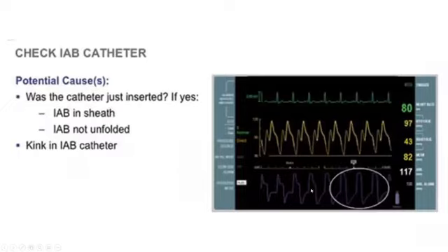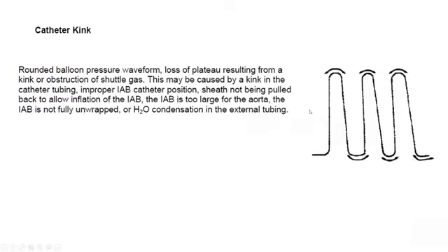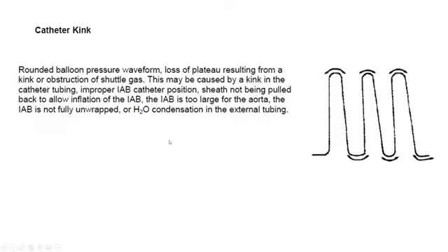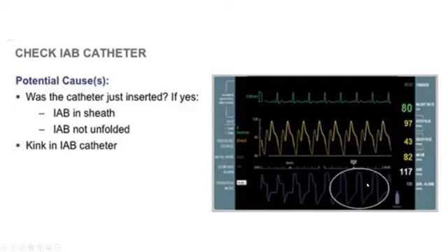And this is an illustration here of a kink, how the waveform looks with kink. This is a kink that's causing abnormal deflation. So the deflation waveform, instead of having two sharp dips, becomes rounded. You eliminate some of those sharp dips. And that comes along with an abnormal arterial waveform, which you don't always see. You will see it eventually, but look in this patient. He has a kink, he has abnormal gas waveform, but the aortic waveform hasn't changed yet. It will eventually if you don't recognize this problem.